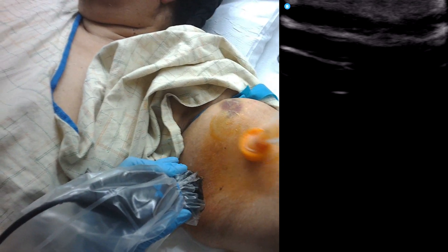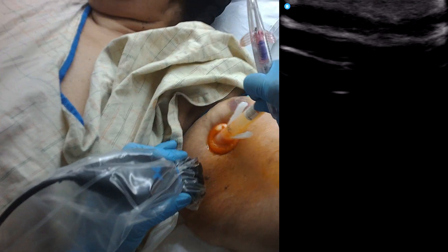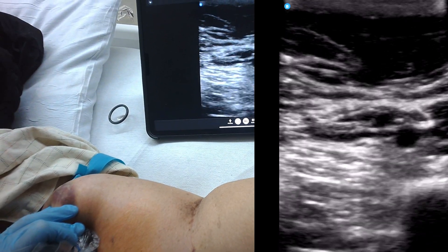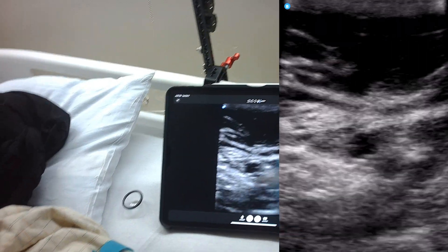We've got a patient here with very deep veins. We are actually just accessing for a blood draw because it's so deep. I'm going to use a Power Glide to reach that vein right there.